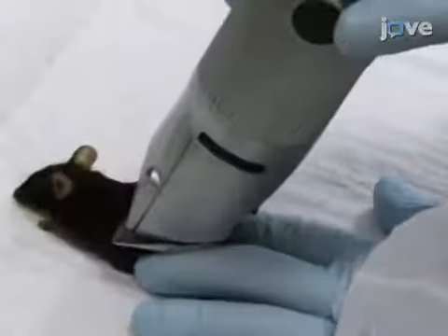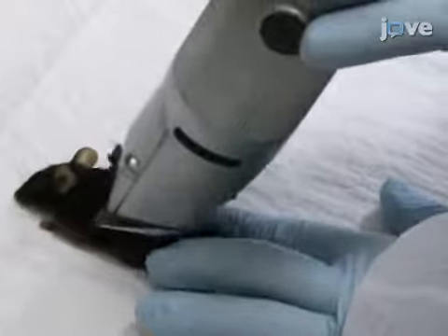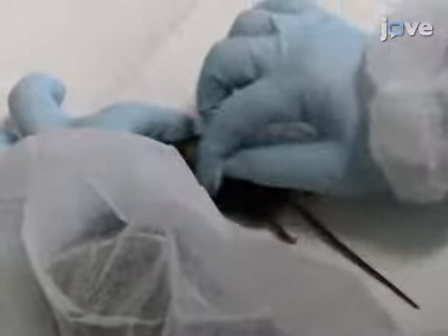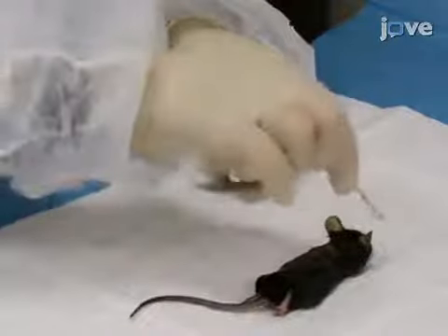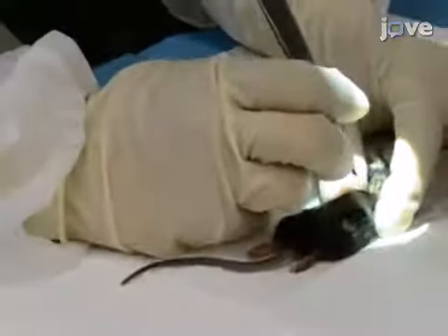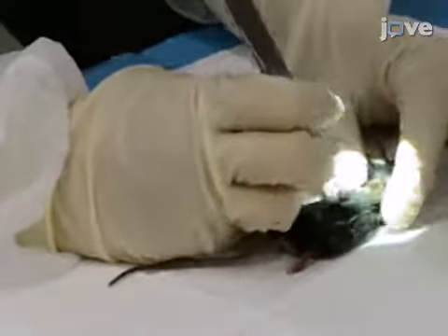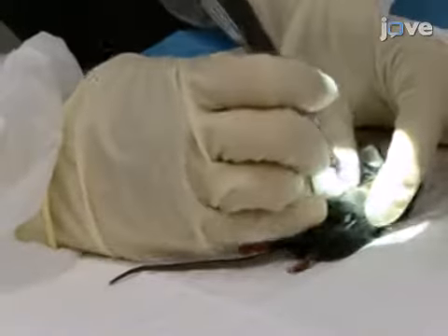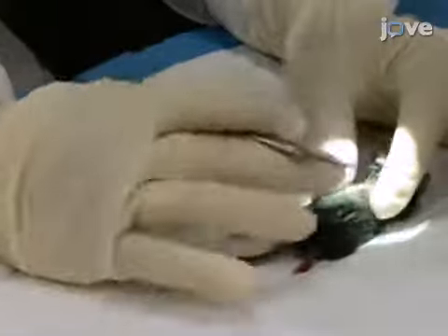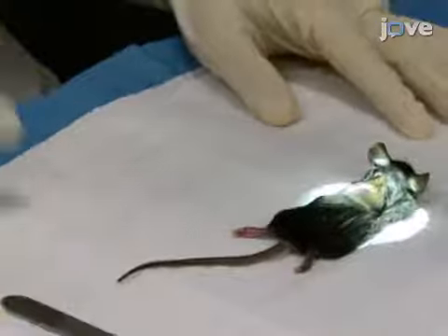Use electric clippers to shave the hair over the thoracolumbar spine. Scrub the skin with betadine solution and 70% alcohol wipes. Apply ophthalmic ointment to the corneas to protect the eyes from drying. After making a 1.5 centimeter midline skin incision on the back of the animal over the 9th to 11th thoracic vertebral laminae, push the subcutaneous adipose tissue rostrally.